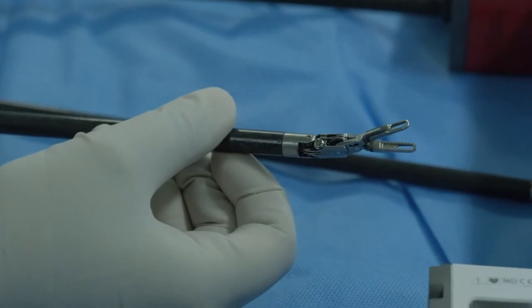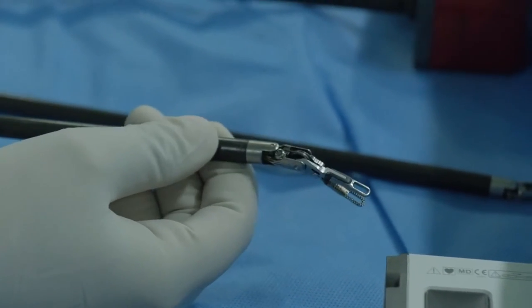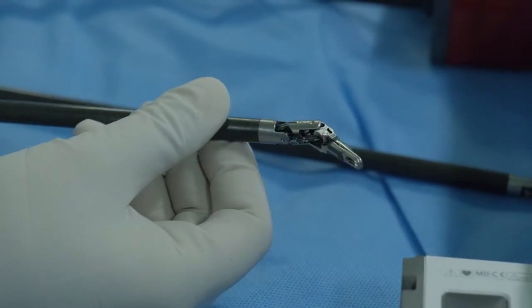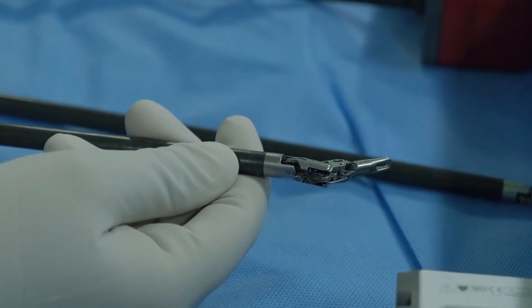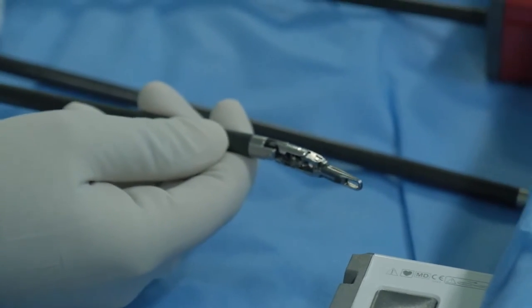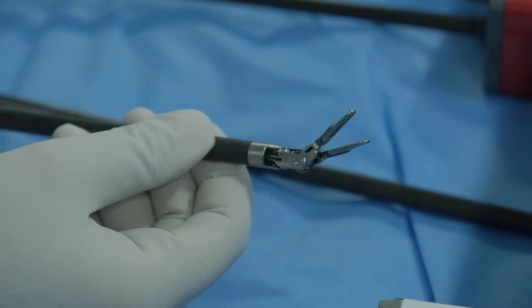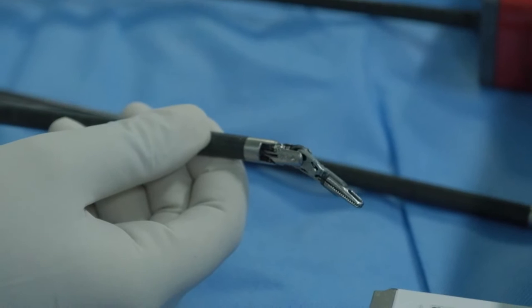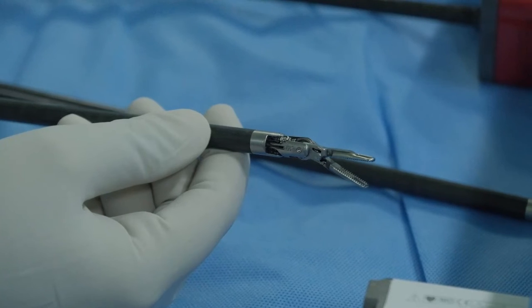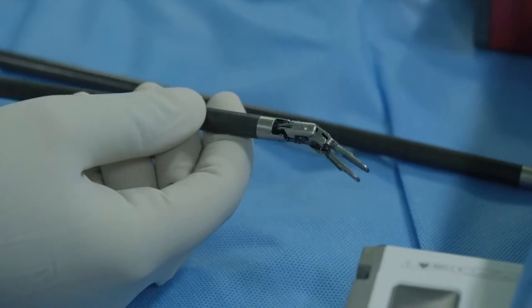You can see how the instruments are moving and it rotates. So it provides 7 degrees of freedom, and it actually has range of motion greater than the human hand, and the precision. So every instrument has a predefined grasp strength. It cannot pinch more than what the system has made it to pinch for. So if it is a ball grasper, it is not going to pinch hard and the intestine is not going to get damaged. But if it is a needle holder, it is going to pinch hard. So you should be aware about the predefined grasp strengths and the energy used in that particular instrument.